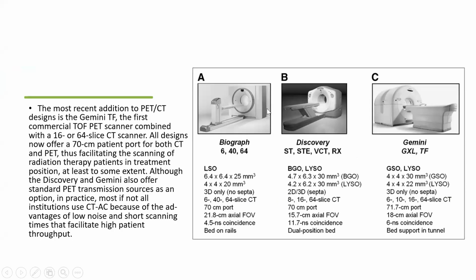So here are some modern PET-CT modalities: Biograph, Discovery, and Gemini. If you notice, all of them have LSO or LYSO, and the port is always approximately the same.